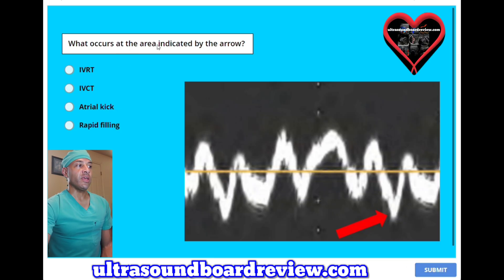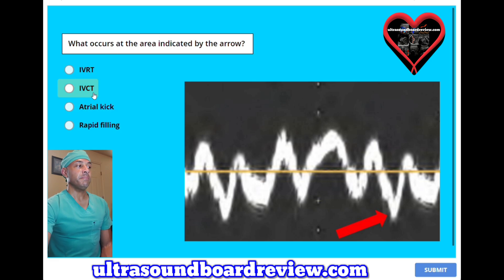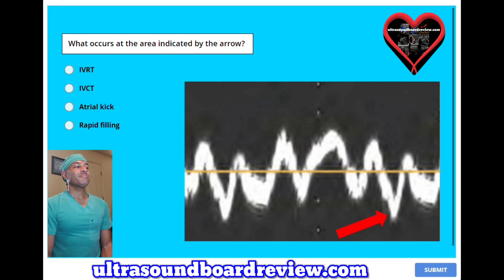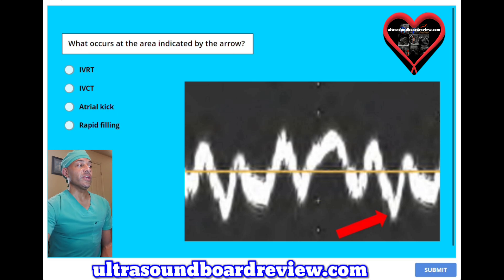What occurs at the area indicated by the arrow? A, IVRT. B, IVCT. C, atrial kick. Or D, rapid filling. The answer is D, rapid filling.